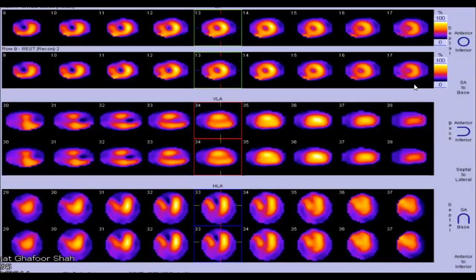Apex is a separate segment on the short axis. And also another partial perfusion defect at the basal level involving the anteroseptal and inferoseptal segments.